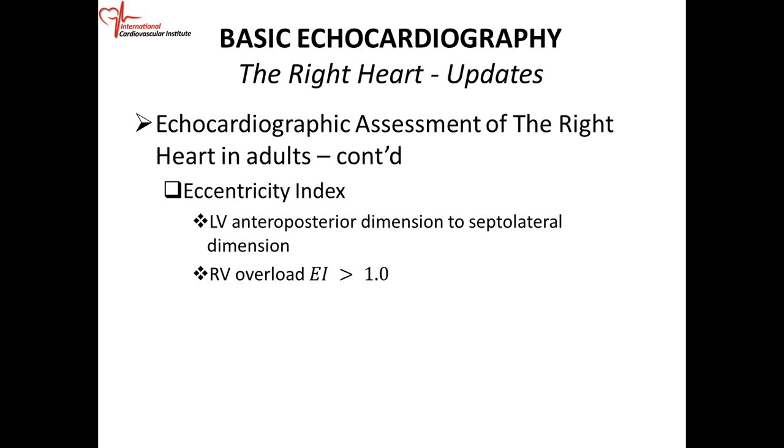But with RV volume overload, remember we said the septum flattens, so the septum to lateral dimension is going to be less.